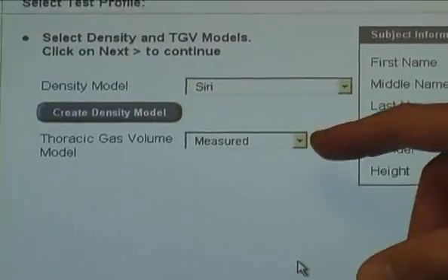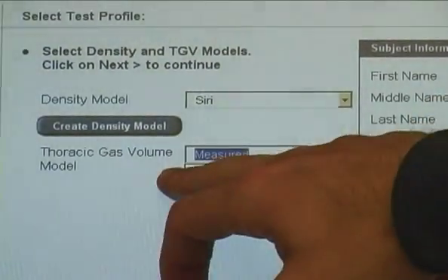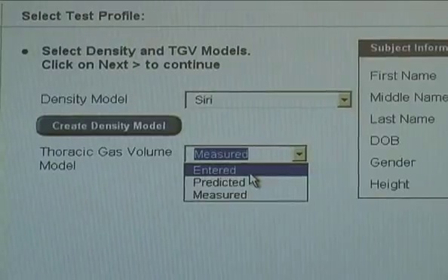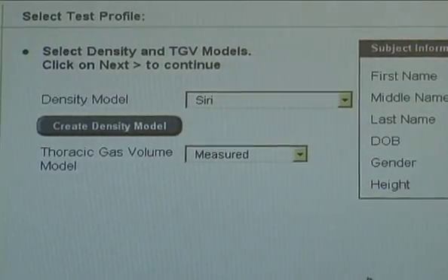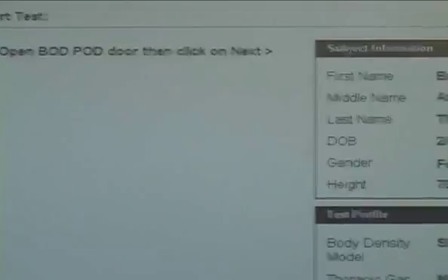Once we test Brittany, if we test her a second time, a line will appear that says retrieved, and that's what I mentioned earlier. We will not have to measure her lung volume, and you could just select her previous lung volume measurement. So we do measure next.